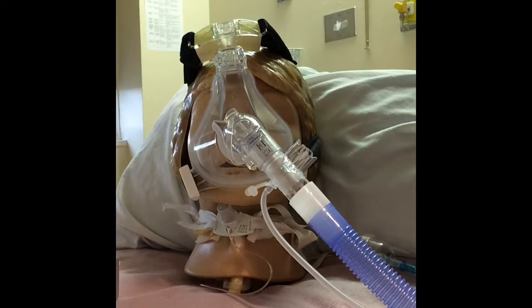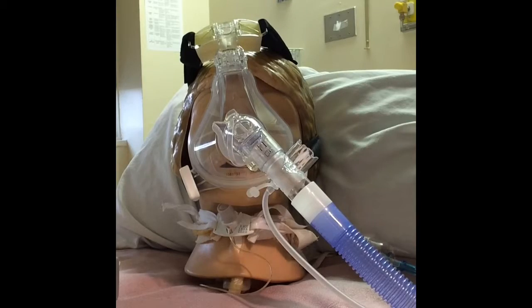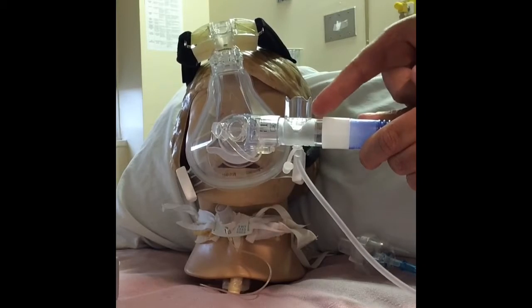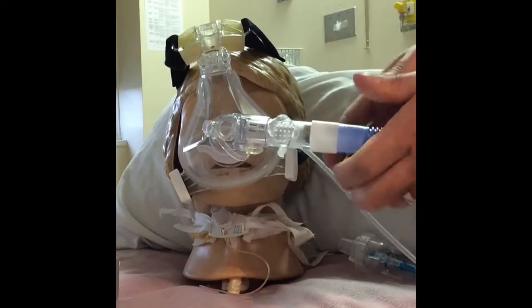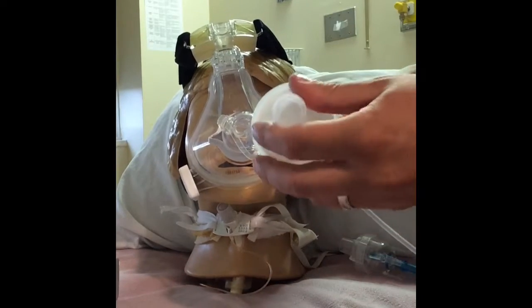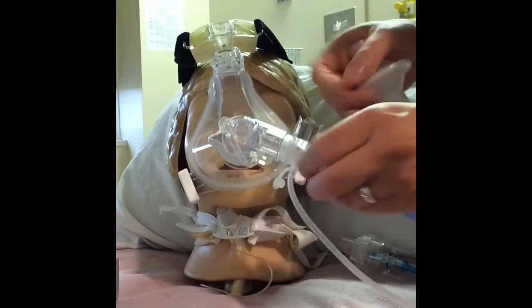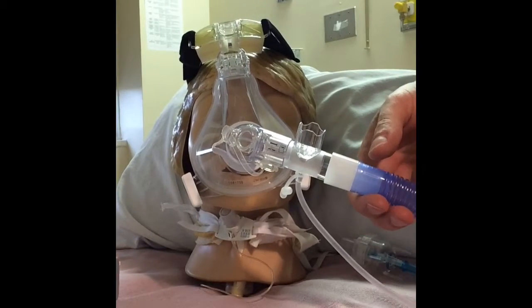Okay, now we'll talk about nebulizers and their setup. You can currently see that this is our disposable exhalation port, and that has changed a little bit. I just wanted to show you. It used to have just a little hole and then it would blow air. Well, now it's a big old opening. This allows us to put a filter on there. So when your patient exhales, this just goes right out into the air. Now we're allowed to put on a filter, so it'll filter that air coming out. So when you see that, you cannot tape this up or plug it up. That's how your patient is exhaling. But I just want to touch on that.